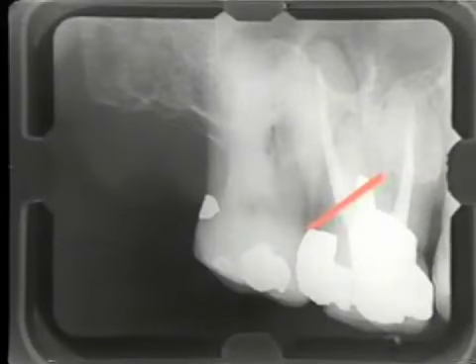In this radiograph, you can see that the lingual and mesial buccal roots have had a gutta percha filling of the root canal, and the distal buccal root is filled with amalgam. We will section the distal buccal root on the angle seen in the radiograph. We will now begin with the procedure.